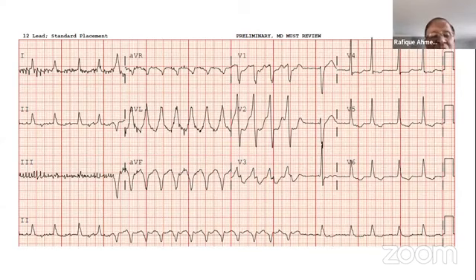So these are the quick points, I thought we should get something out of this, because this is a common question that we get asked: is it aberrant conduction? And the other thing you have to look at, to get aberrant conduction, you normally require a long-short sequence, but we don't have that long-short sequence here. So why would the first beat suddenly become aberrant? So all those criteria point to non-sustained VT. Of course, I mean, the treatment. The axis changed, and the RR interval is very regular in the middle of this.